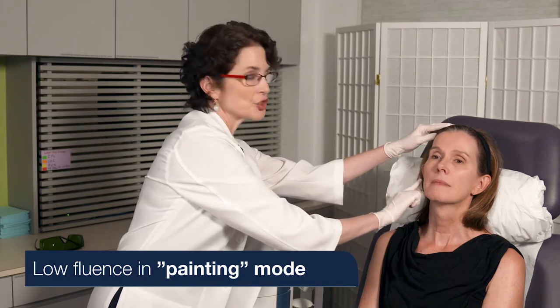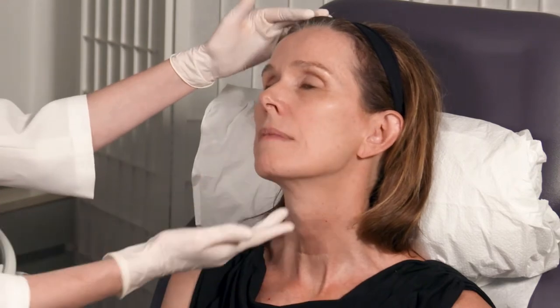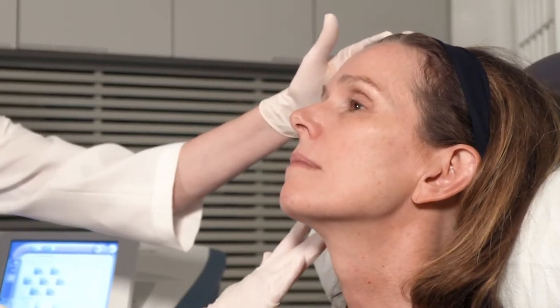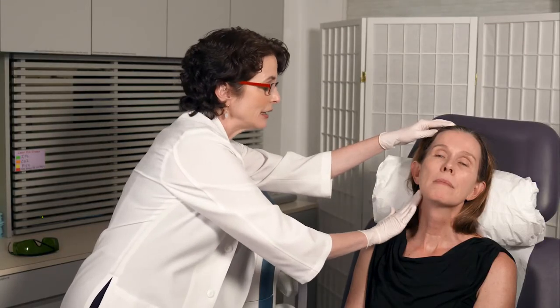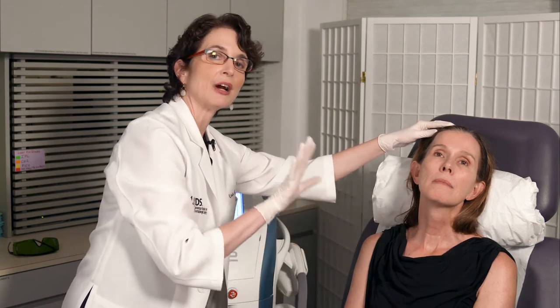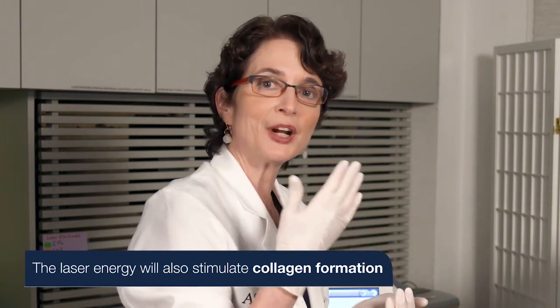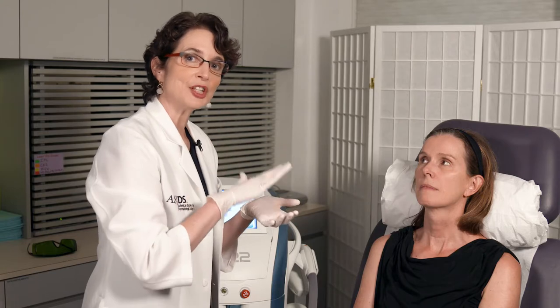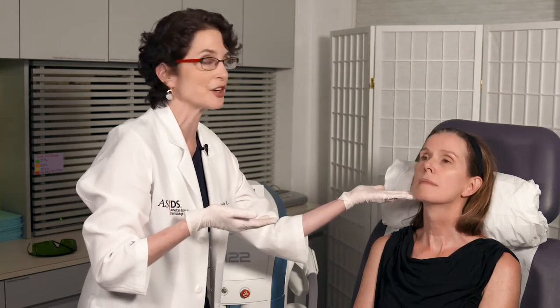We're going to paint — just go over and over these areas. I'm going to treat the entire face and today we're also going to go down and treat her neck. Done repeatedly, this will definitely lighten up this chronic background — what I call pigment noise. At the same time, because we're putting laser energy down into the dermis, every time we put heat there we're going to stimulate collagen, up-regulate collagen type 1, and decrease collagen degradation, giving a global improvement of skin texture and tone.